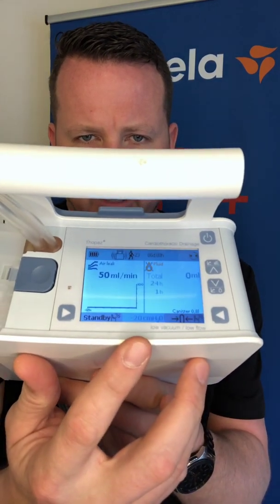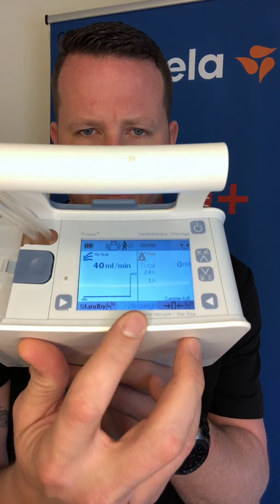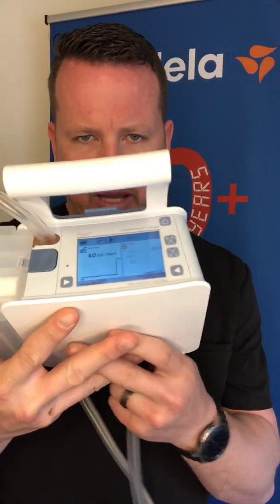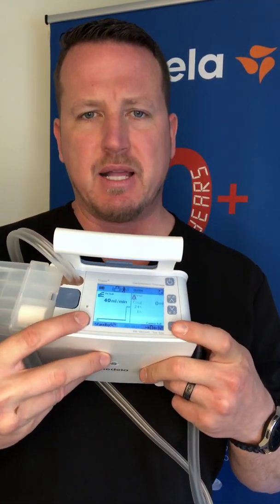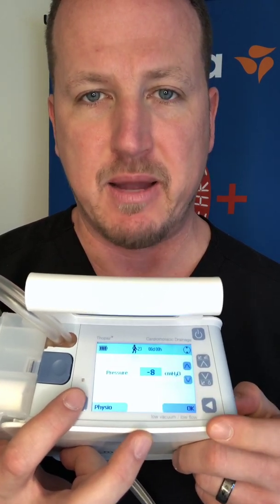The bottom center of the device shows the patient's therapy pressure, in this case at negative 20 centimeters of water. To change that number, press the lateral arrows simultaneously to highlight the pressure, then use the up and down arrows to get to the ordered pressure. If the ordered pressure is negative eight or water seal, press physio to go right to negative eight. Regardless of the pressure selected, press OK to lock in that pressure, otherwise it will revert back to the previous pressure.